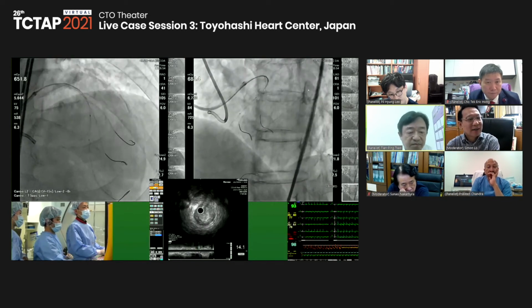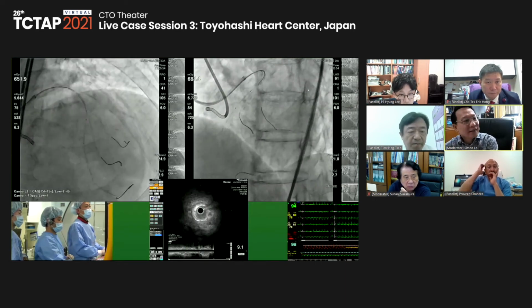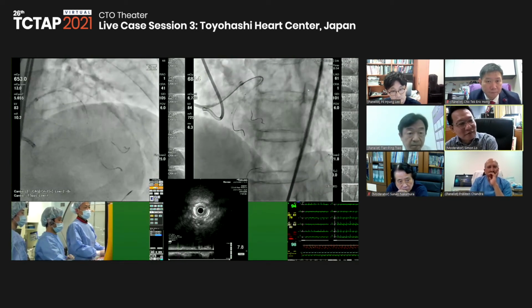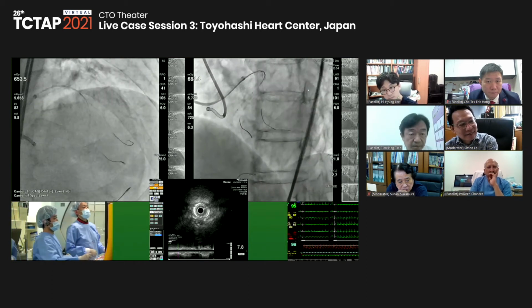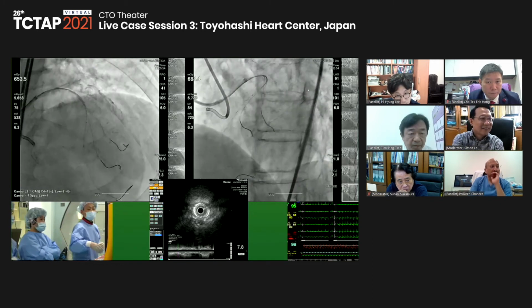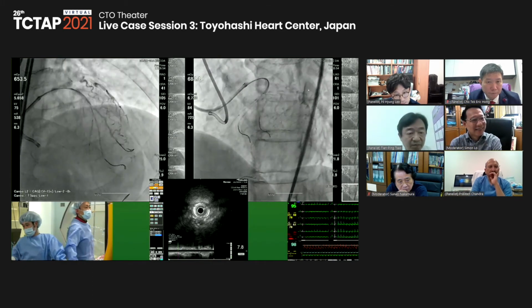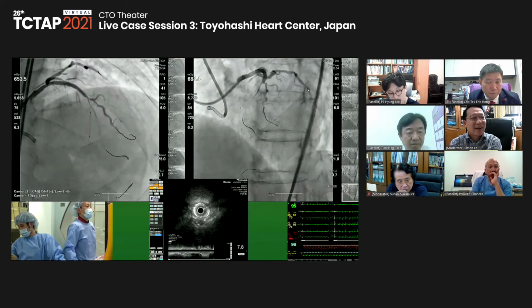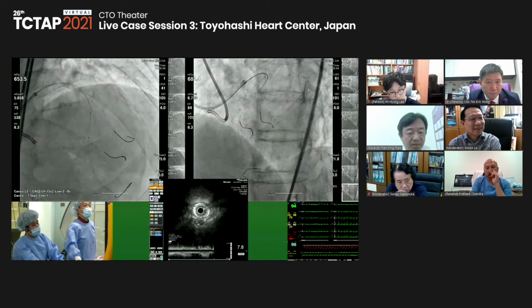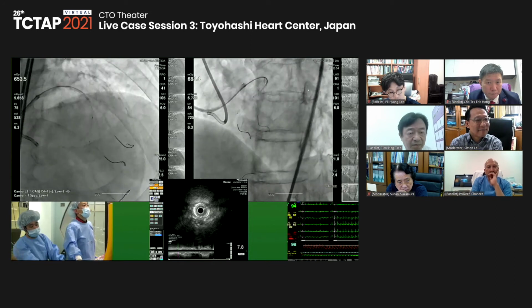Yes. Now, this is interesting because the ostium of the first diagonal does look very hazy. So would Dr. Nasu pre-dilate this first diagonal? Yeah, I'm wondering. I already dilated the second diagonal for sure. Yeah, it's a smaller diagonal. Anyway, I want to use the balloon protection for stenting for the first diagonal. So maybe I don't need to dilate it before stenting. But the size is maybe 3 or, but the length is 38 or 30 something, I guess.